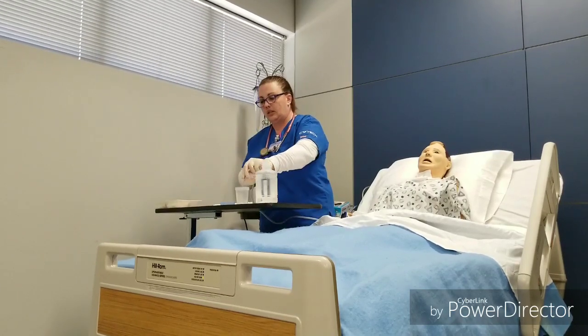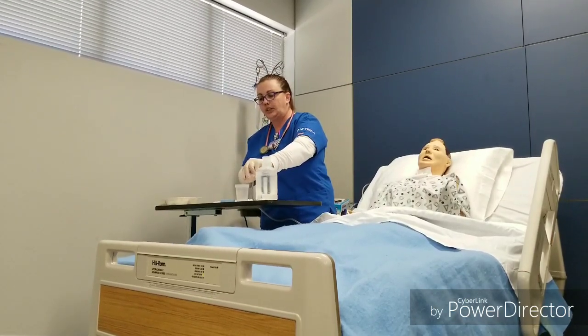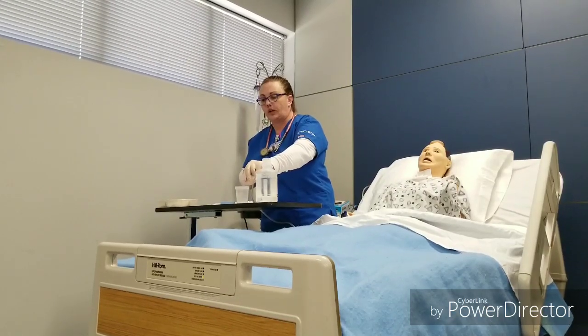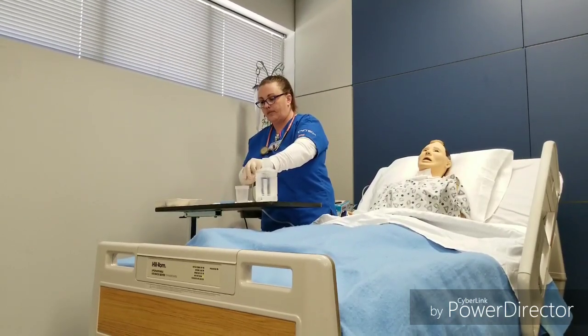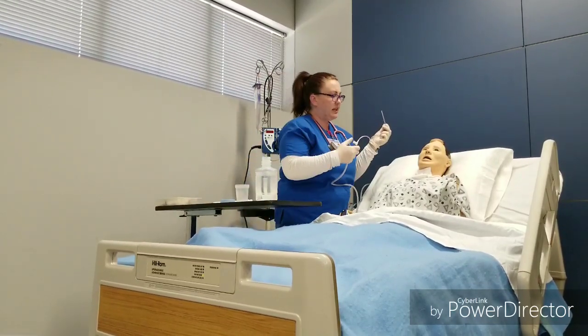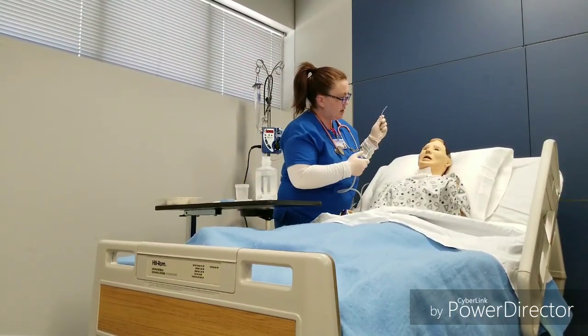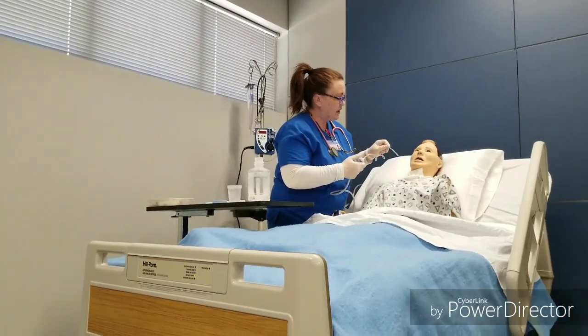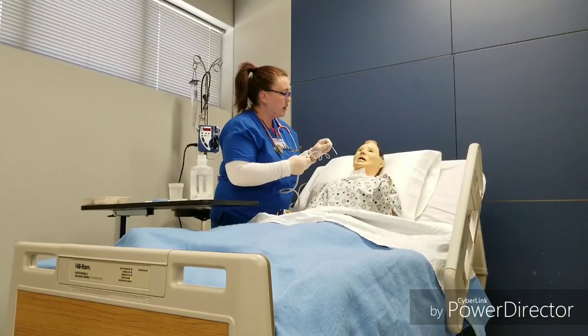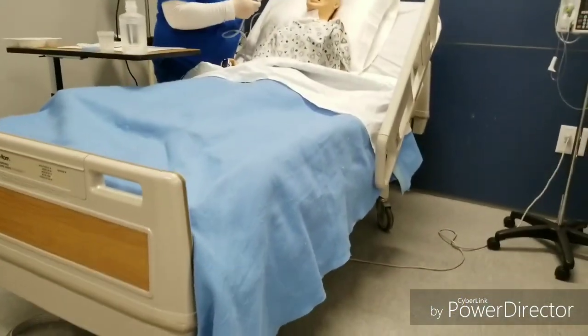You want to moisten this and check for suctioning. You're going to hear the water go into the tubing if your suctioning is working properly. All right, Mr. Smith. I'm going to now suction your trach. You let me know if you are uncomfortable at any time and I will stop.